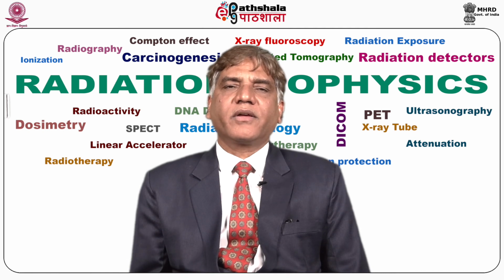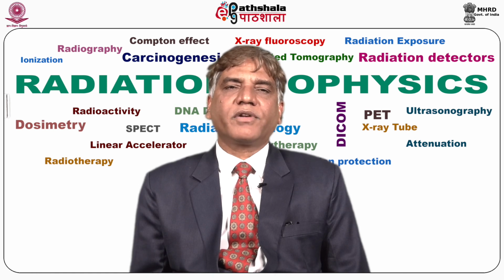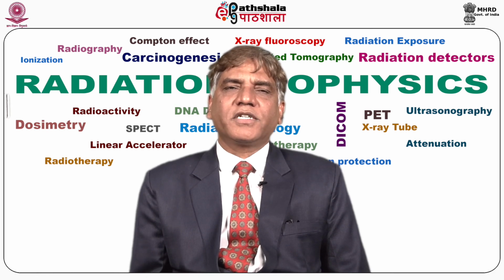But again here there were disadvantages of the second generation CT scanner: increased scatter radiation as compared to first generation CT scanner, and complicated mechanical motion of translate rotate. Again sodium iodide detectors were used, for which there was an afterglow problem, and complex mechanical rotation. Then the third generation CT scanner was introduced into the market.